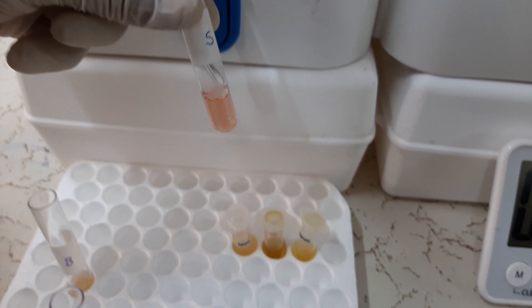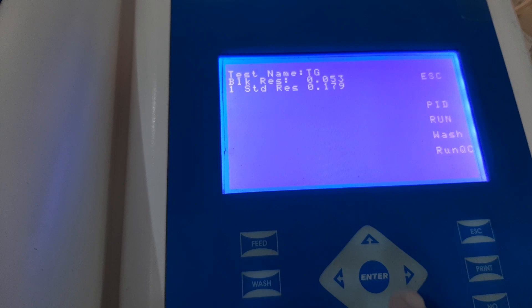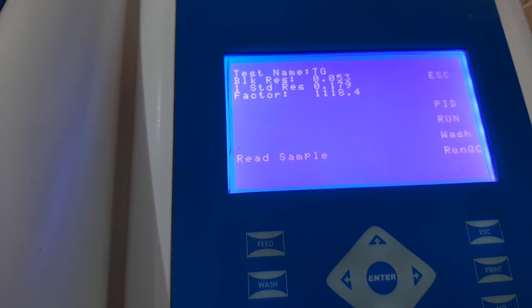Now the instrument gives the instruction to read the standard. So we will take the second tube prepared for the standard and aspirate the reaction mixture into the instrument. After a small lag time, the instrument will give a message to re-run the standard — we will select no because we have taken only one tube of the standard. The instrument has now calculated the absorbance of the standard and also calculated the factor.